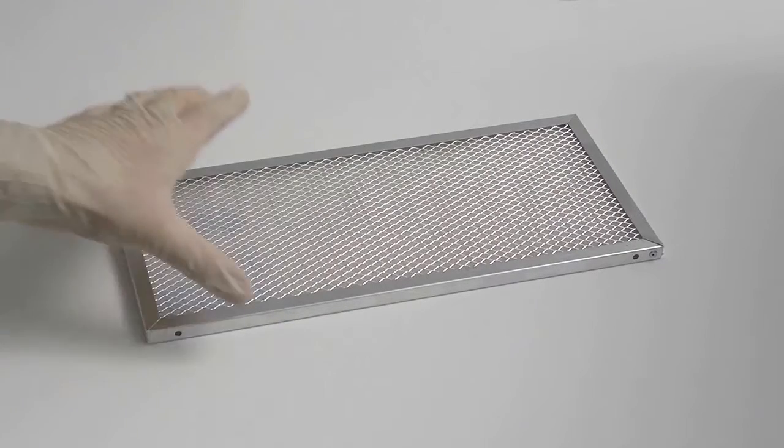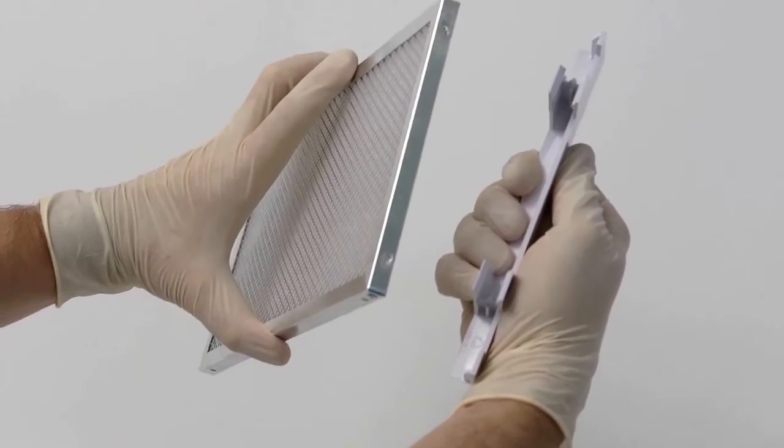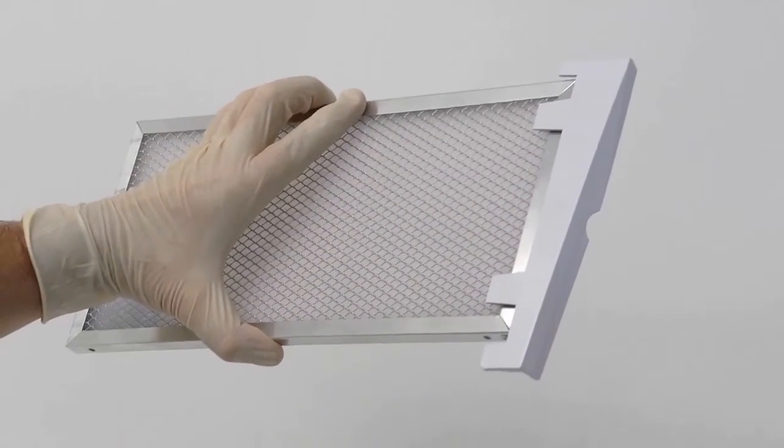A new filter can now be fitted to the dust filter handle. The two holes present on the filter should be lined up with the location studs on the handle. The filter can then be reinserted into position.